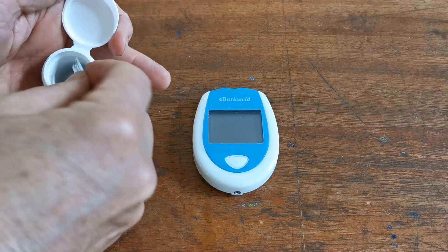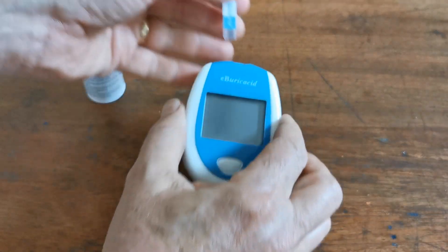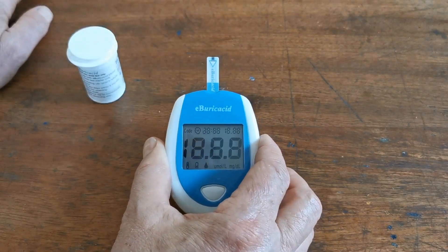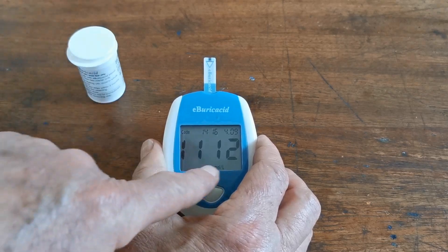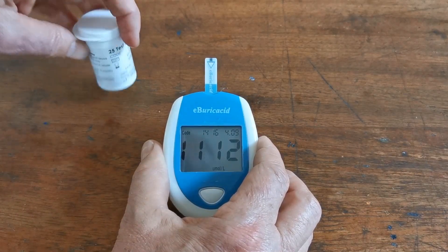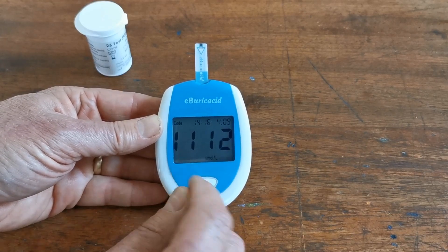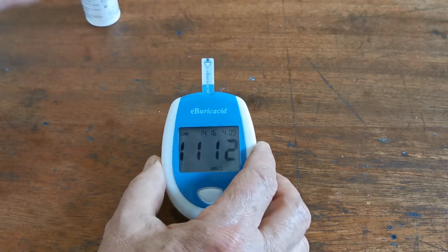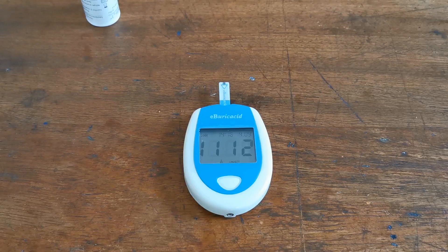When you insert one of the test strips into the top of the meter it automatically switches the meter on, shows the correct code number, and you'll see a flashing indicator asking you to insert the blood sample into the top of the meter. Let's now demonstrate the best technique for getting a blood sample.